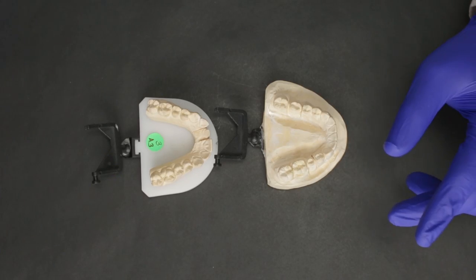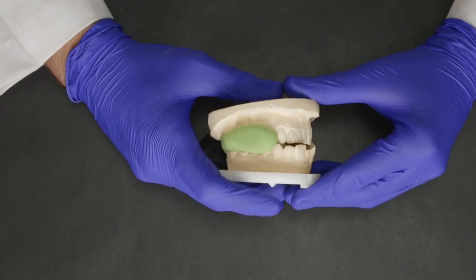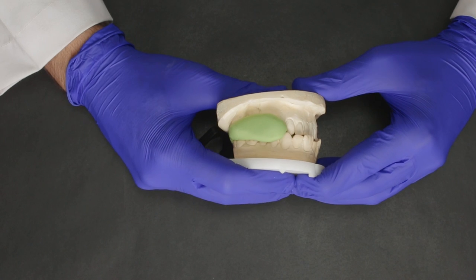Another common mistake that some dentists make is registering a bite with putty. Because of the elastic nature of putty, it kind of bounces up and down when you try to articulate the upper and lower models. This can obviously cause a major problem as far as occlusion is concerned.